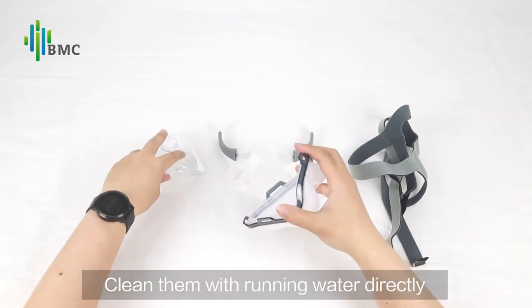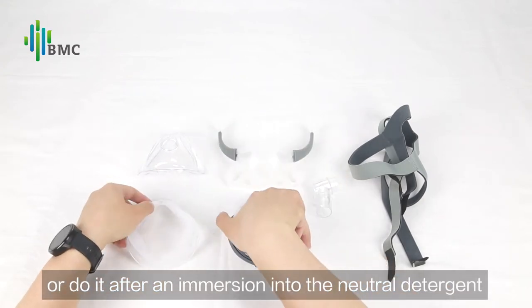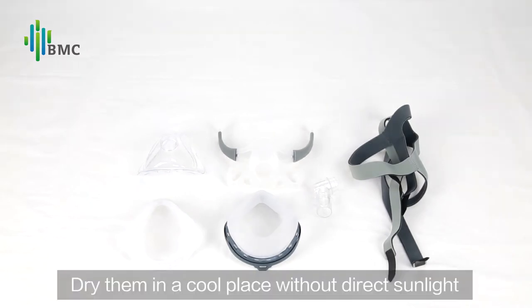Clean the components with running water directly, or after immersion in neutral detergent. Dry them in a cool place away from direct sunlight.